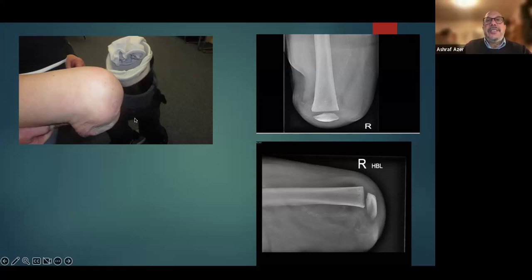So then it will be an ugly socket, because the socket has to go around the prominent condyle. So Gritti-Stokes decided to remove the condyle as if it's a long transfemoral, keep the patella denuded from the cartilage and attached to the end of the femur, reflected or attached to the end of the femur through Ethibond or something. I personally, and all my rehabilitation colleagues, hate this type of surgery.